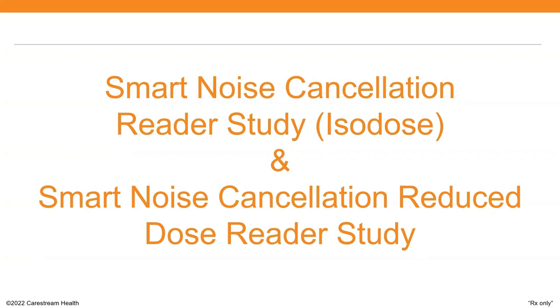Two independent reader studies were performed. The first assessed the image quality impact of noise reduction, where the same image was processed with and without SNC. This is also referred to as the isodose study. Then I'll give you an overview of our reduced dose study.